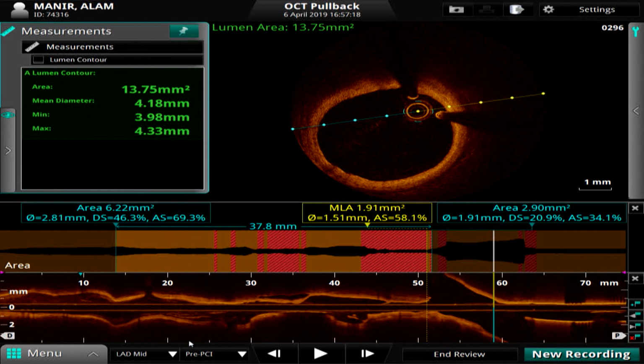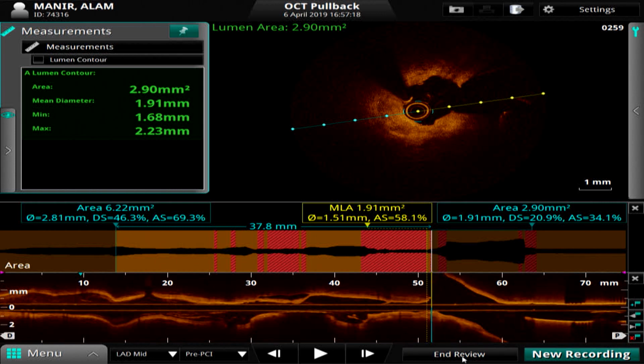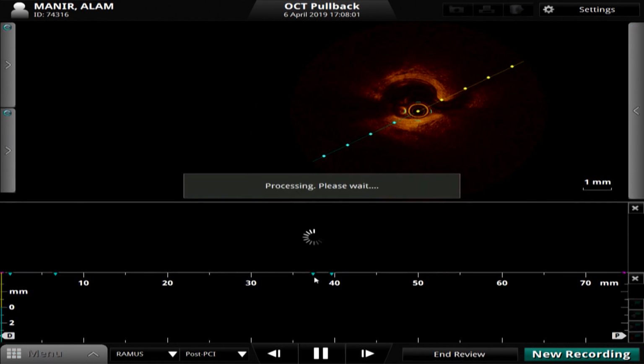So we will place it in a V-shaped fashion, however, without extending much stent into the left main, and then we'll optimize it with OCT-based guidance. We have also done a balloon angioplasty in the ramus, and then we have done an OCT of the ramus branch. Can we see that? Yep, that's the next step we're going to show you. This is the OCT of the ramus.